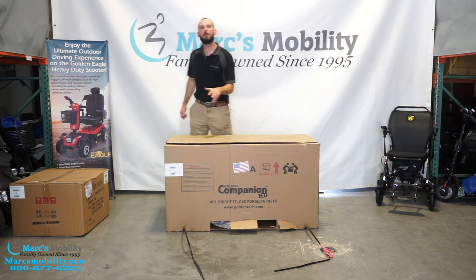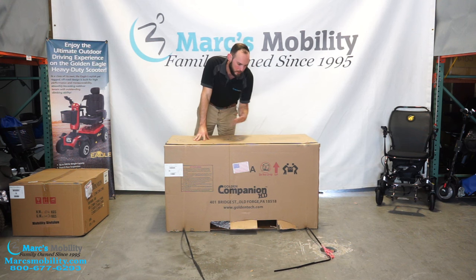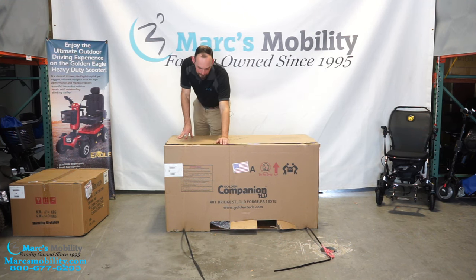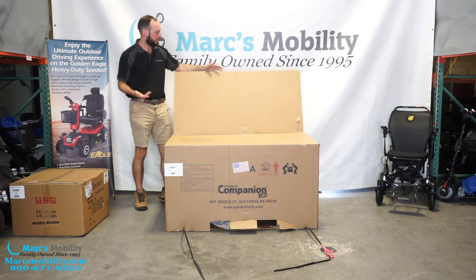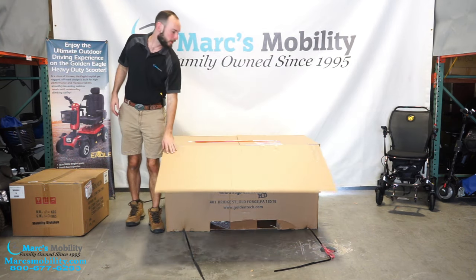There might be staples holding the front of the box together. I see holes where staples were but I don't see them in this box. Just a heads up — you might have to remove staples. I don't want you getting cut if there are any. There's not in this box, but you can see where they were, so exercise some caution there.